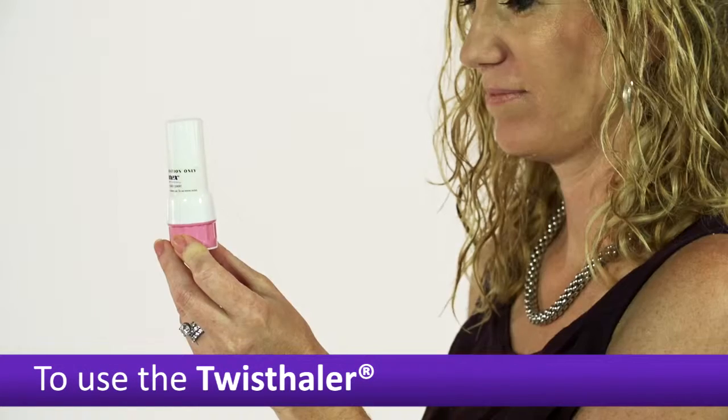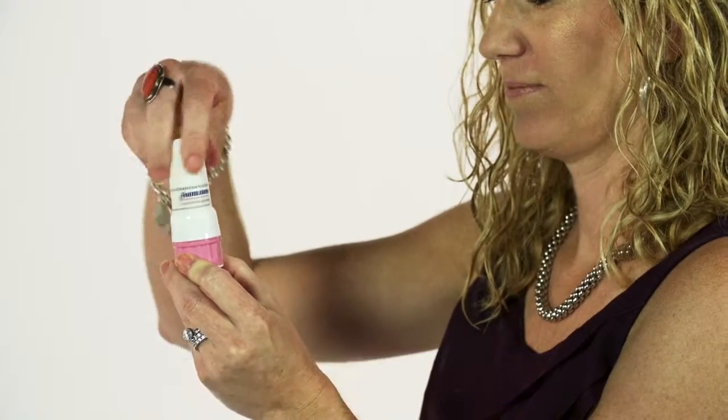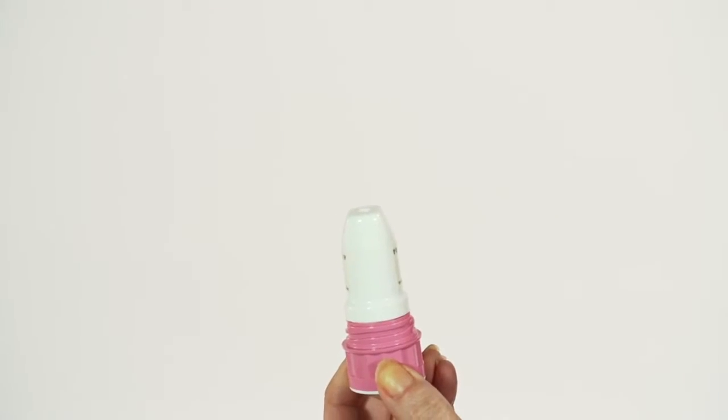To use the Twisthaler, hold it upright by the pink colored base. Still holding it vertically, twist the cap counterclockwise to remove it. This also loads the next dose.